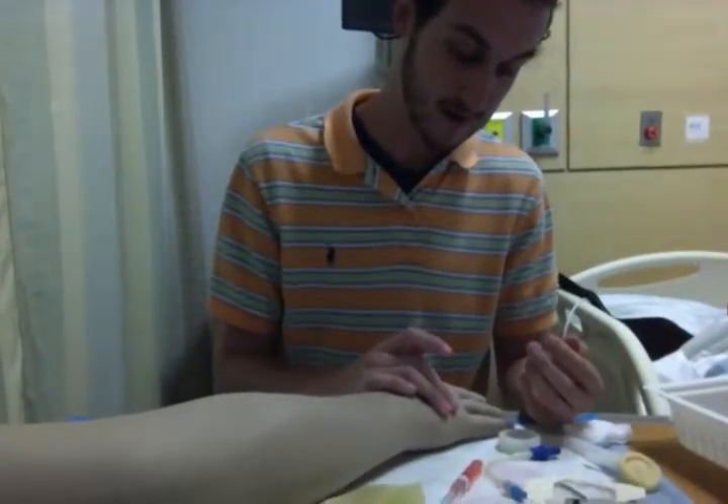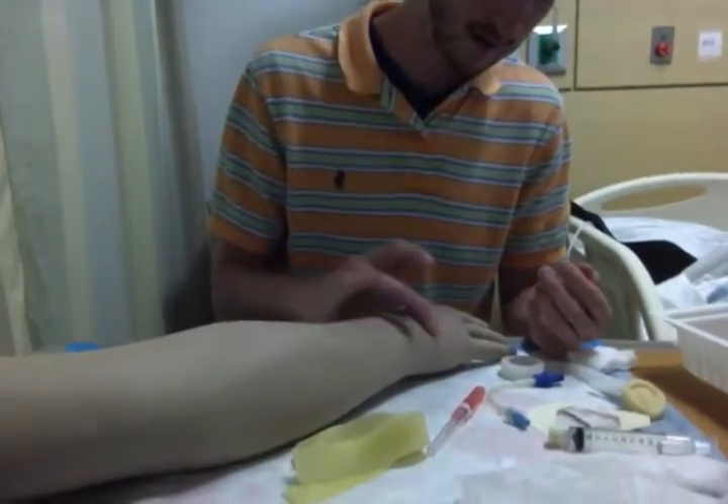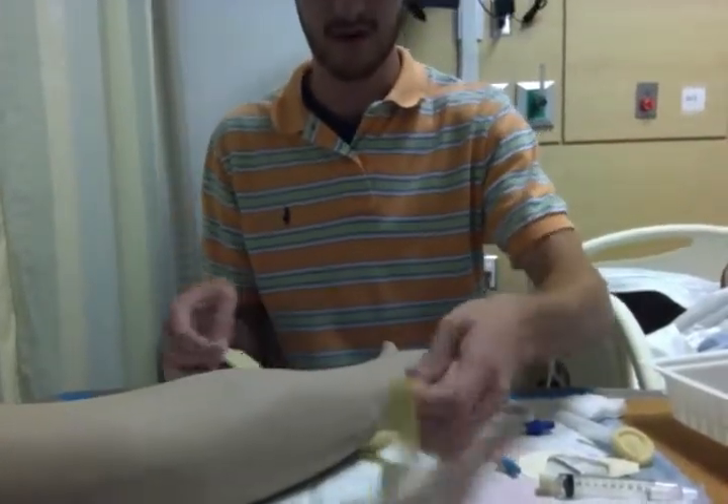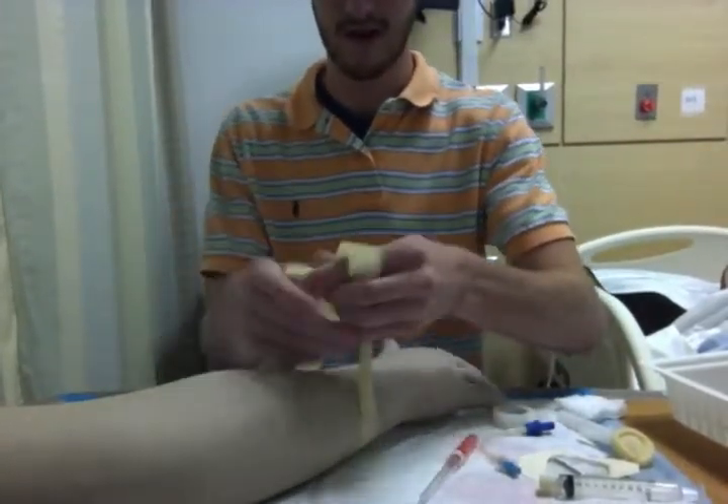Next I'm going to check to see if I can feel a vein. Once I felt one, I'd apply the tourniquet. It's only kept on for two minutes at the most.